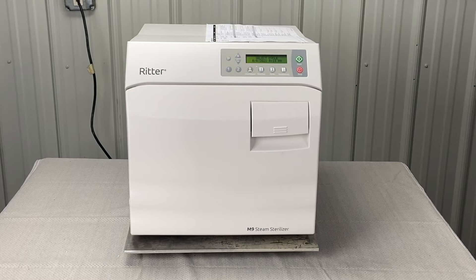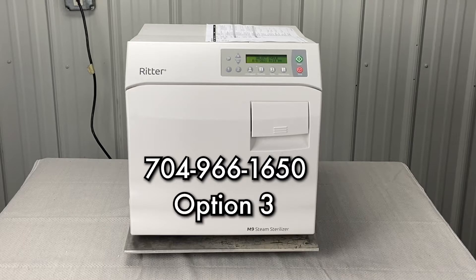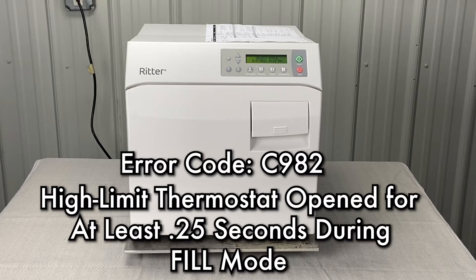Andrew here, Sterilizer Autoclave Solutions, 704-966-1650, option 3 for free technical support. We're going to talk about the Charlie 982 error code: high limit thermostat open for at least 0.25 seconds during fill mode.